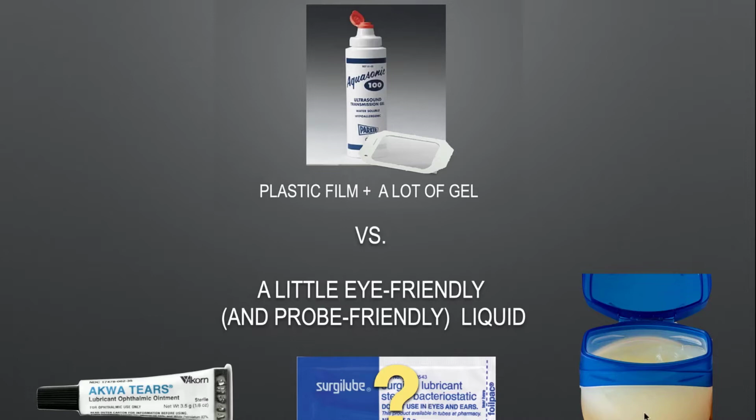There's a couple of papers about emergency medicine physicians using petroleum jelly because this is a fairly safe material for eyes. However, our manufacturer tells us that it's not a particularly safe material for the ultrasound probes themselves. So if you are going to use petroleum jelly on the eye, what I'd recommend is that you put a very thin layer of ultrasound gel on the probe itself. So basically thin, tiny little layer, and then put Tegaderm over the probe. And then you can just go ahead and use that on petroleum jelly on the patient's eye.